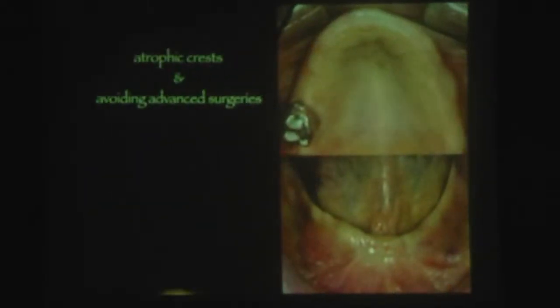And look, I didn't make any prosthesis. This prosthesis is my patient's former prosthesis. I only made implants, okay? But I made the scanning. I think Pratik will show you, okay? I made the scanning. I got the picture with all views, and after it, I could do everything. So the treatment went well.